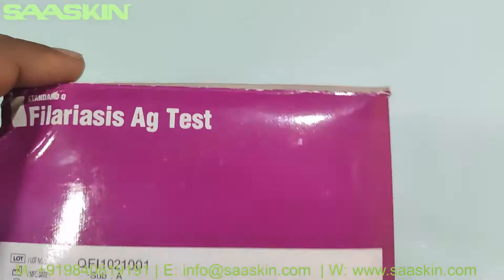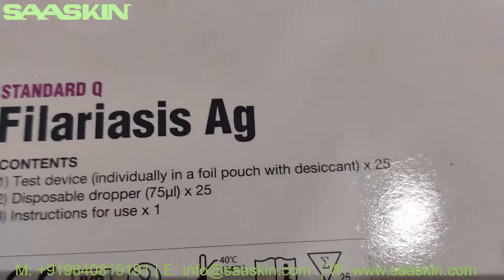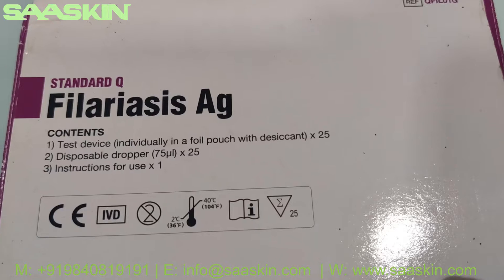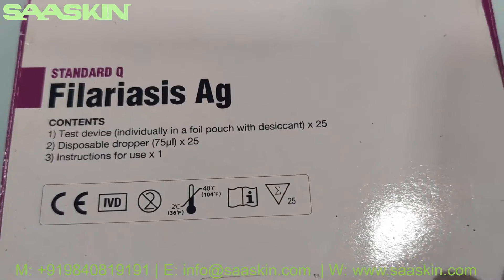On the other side we have two years of expiry. This is the front. In this box you get 25 test devices, 25 disposable droppers, and the instruction for use.